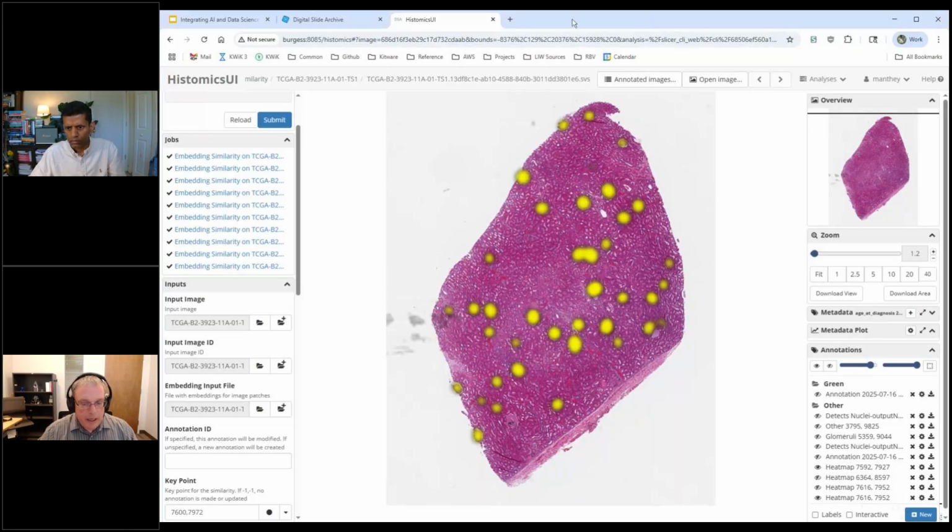And so, anyway, this is just showing off a relatively straightforward example. The code on this is available on GitHub, and this one I tried to document fairly clearly to make it easy to follow, and feedback is most welcome when you get there.